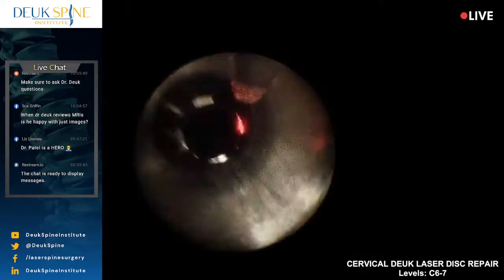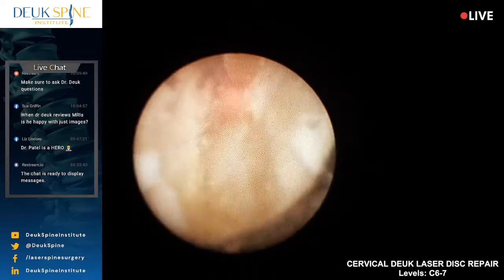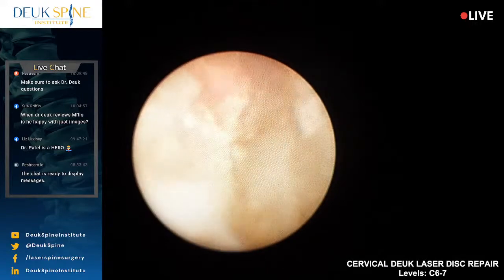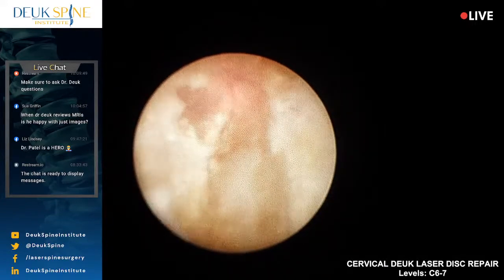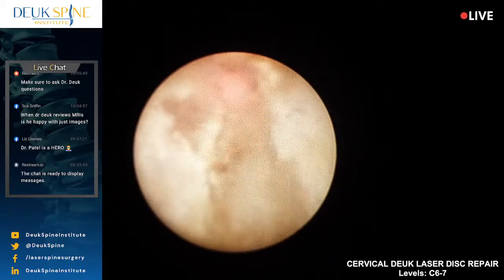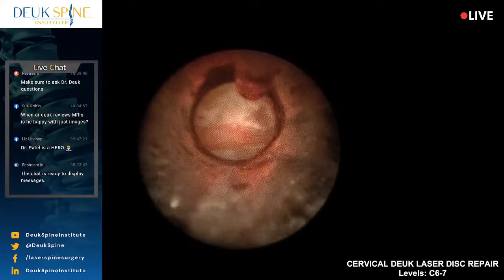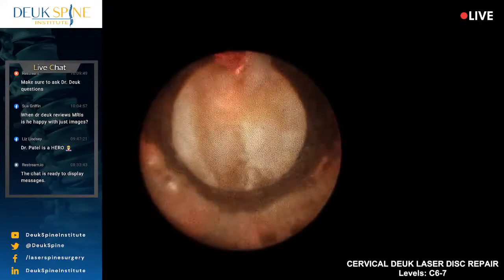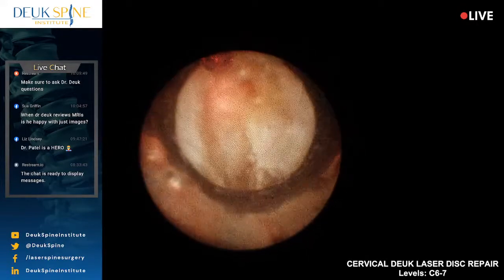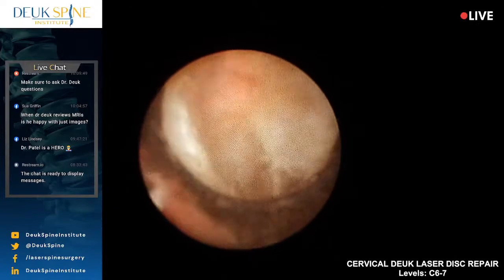So the perfect MRI review for me, I have some history from the patient. Like, all right, they have neck pain, they have right arm pain, they got weakness. I have the MRI images, the T1 and T2 weighted sagittal and axial images particularly, and they were loaded on DICOM. The reason DICOM is important is because we have a special computer program that allows us to look at DICOM images called the PACS system. And the PACS system lets me manipulate the images, measure things, and it gives me the ability to really look critically at an MRI and scroll through it in the way I like to look at it in detail. I'll look at a set of images, scrolling through them on the PACS system. If they're DICOM loaded images, I'll look at that like 15 times, each area, especially the bad areas.